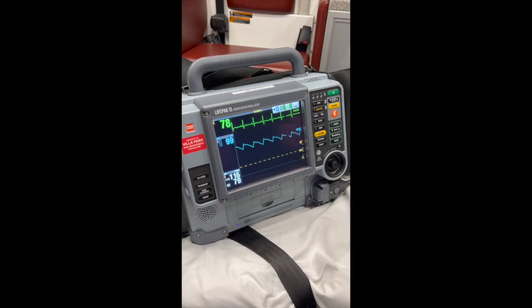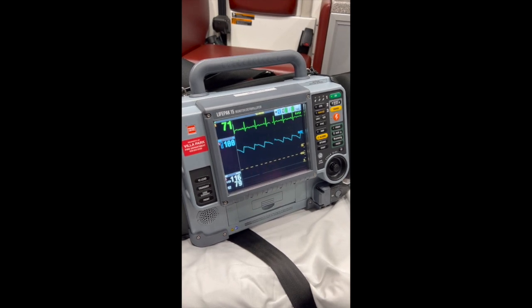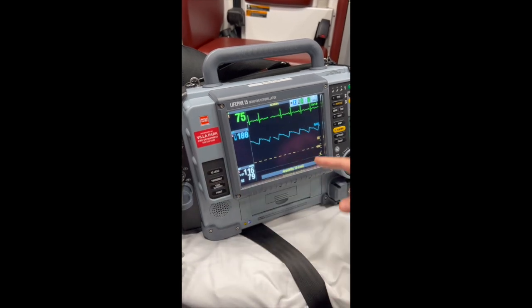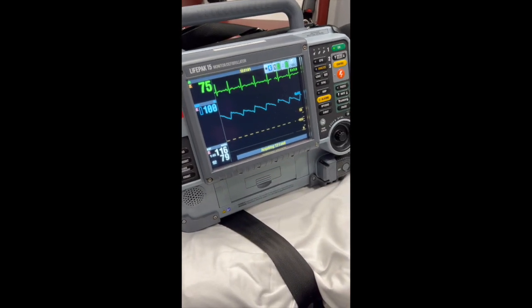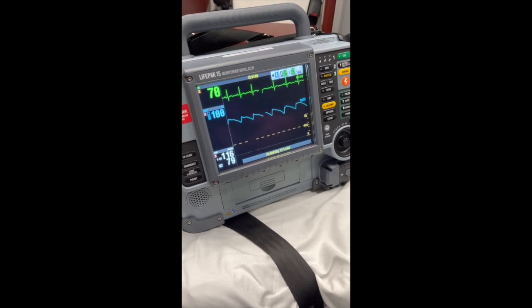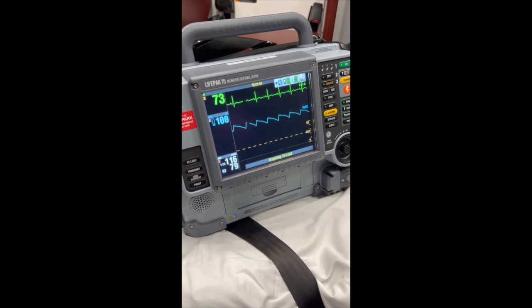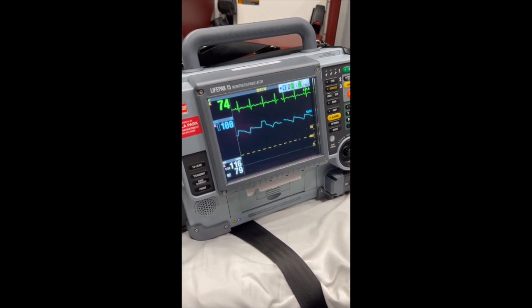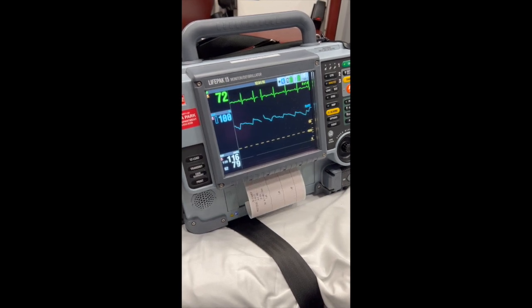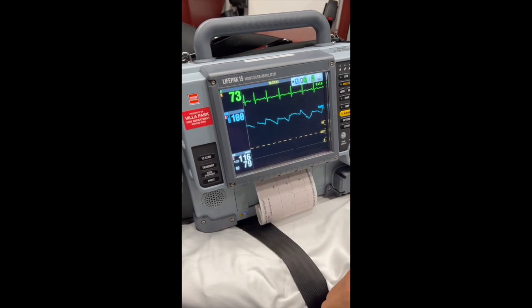Okay, we're going to review how to send things from the monitor, specifically a 12 lead. When you've selected a 12 lead, acquire a 12 lead from your patient. And as this is processing, we can transmit the 12 lead to the hospital if needed. The hospital defaults to Elmhurst Hospital. You can change which hospital it goes to once it's done printing here.